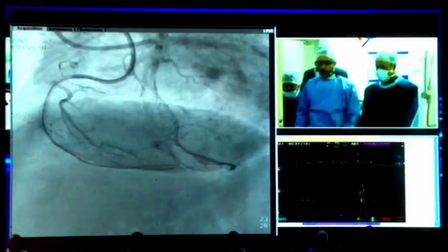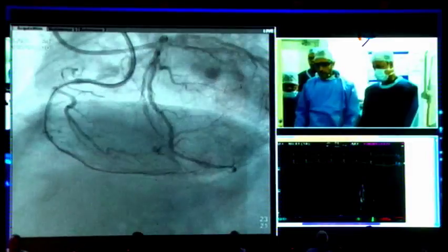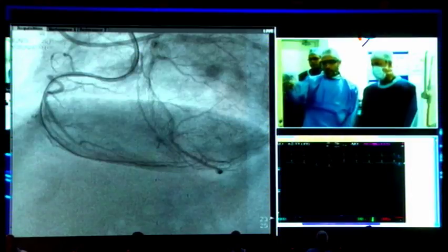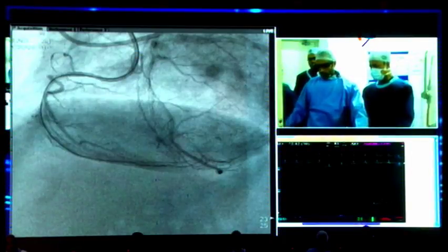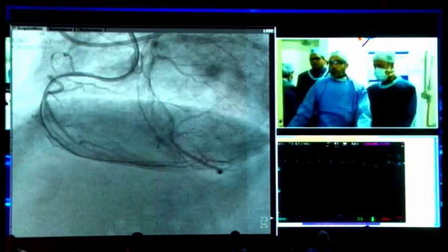All right, still got to figure out how to get in there. Okay, good. Now give us the Prograph again. So I'm going to come back here and see if we can get it. Why don't you take only one injection of the RCA in this? We don't take two simultaneous injections, just one RCA injection. You know what? Go a little bit cranial. More cranial, please. Yeah, that's actually ideal.